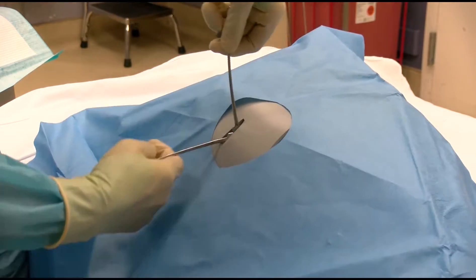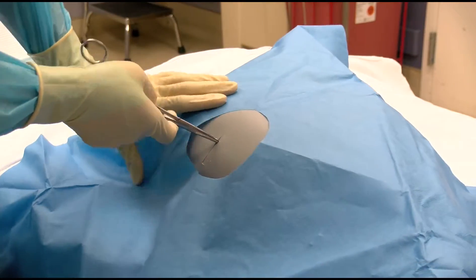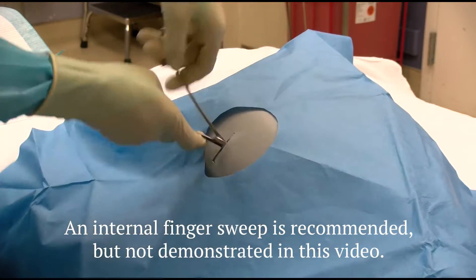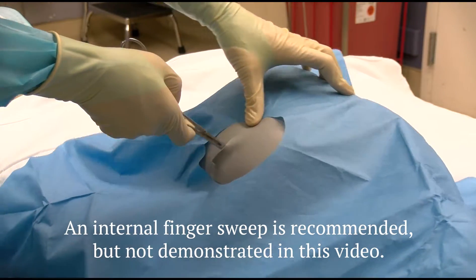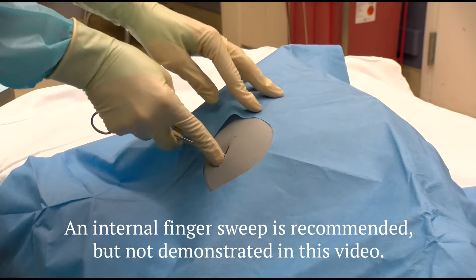Once inside the chest cavity, spread the hemostats to tear the muscle and make a passage large enough for the tube to pass. Insert your finger and ensure that you can identify the passageway and confirm that you are in the thoracic cavity. Try to palpate the lung during respiration.